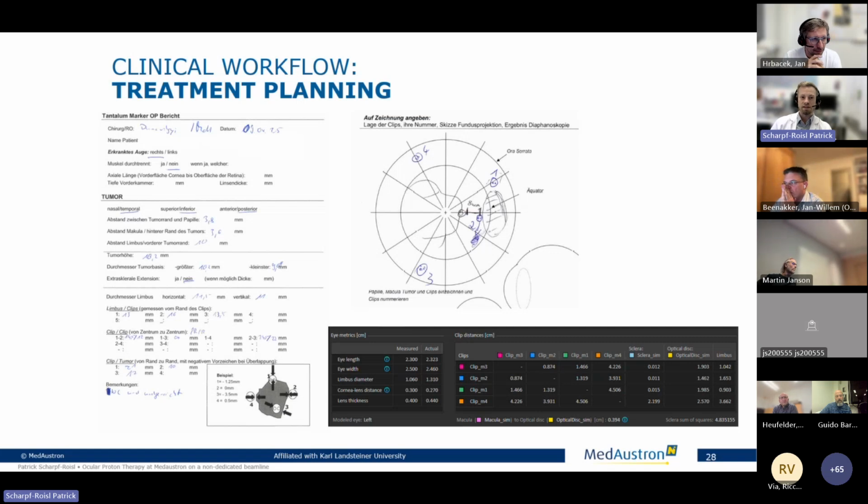But I have to say that the maximum size I would drill of collimator shape is limited currently to 28 millimeters, because beyond that I could not use a single central spot, but I would need to start spot scanning. Otherwise I lose the homogeneity, because of course it's then a Gaussian distribution at some point and not a flat homogeneous distribution within the collimator shape anymore.